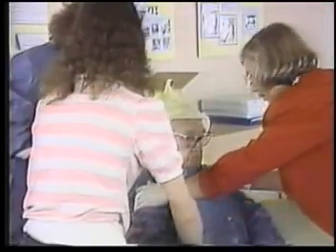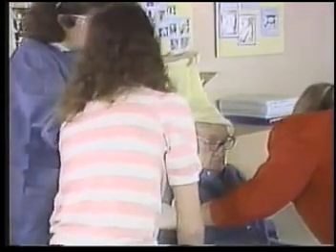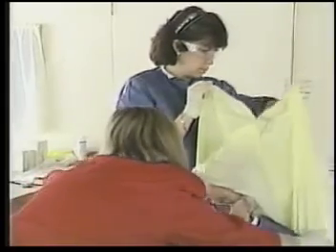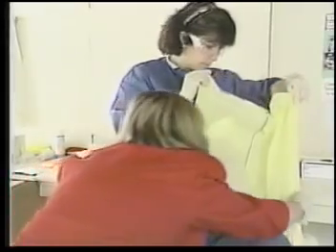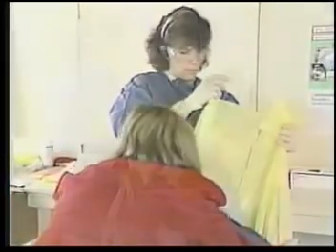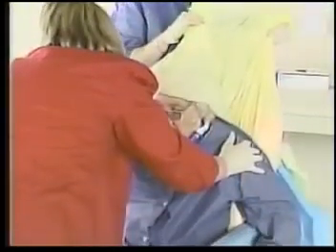Lean the client back while the therapist adjusts positioning. Gently hold the bag up to contain the rising foam. Do not stand directly over the top of the molding bag as some fumes and gases are escaping. Allow about 5 to 7 minutes for the foam to rise and cure. Afterwards, the client can be removed from the chair in order to do the rough trim.